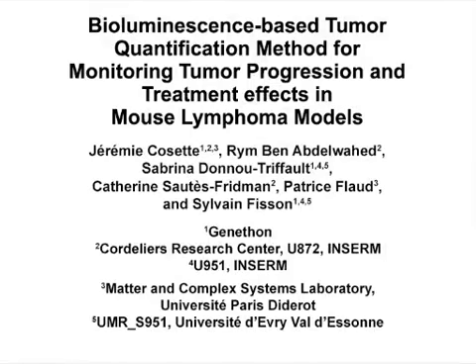The overall goal of this imaging procedure is to standardize bioluminescence acquisition procedures and image analyses to obtain quantitative data for comparison within or among different experiments. This method can help answer a key question in the bioluminescence imaging field, such as how can imaging data be quantified in a reproducible way.